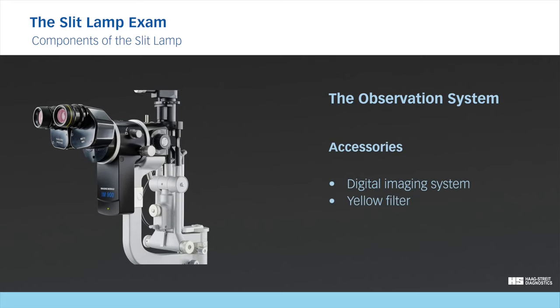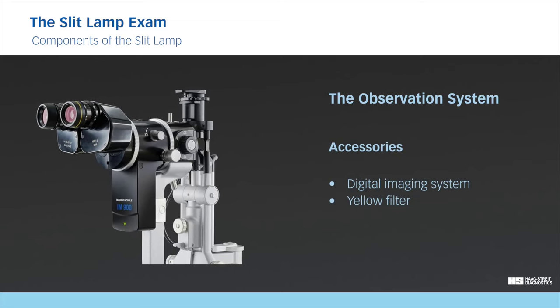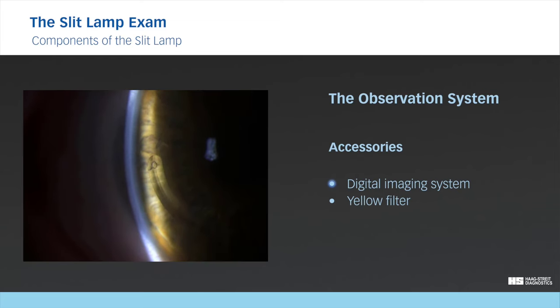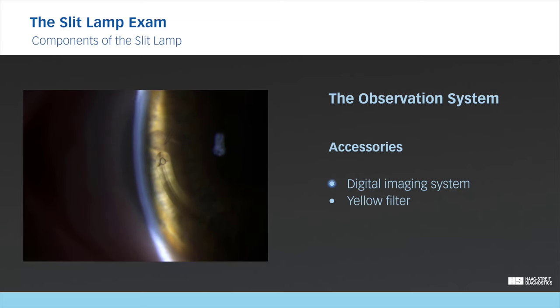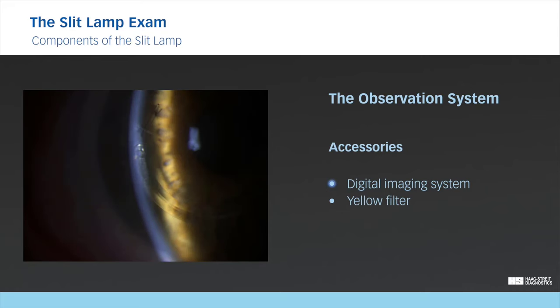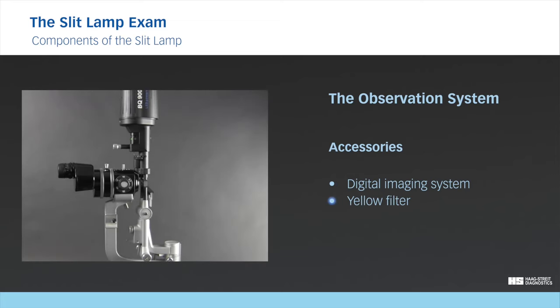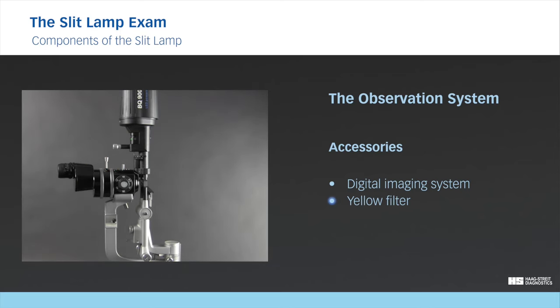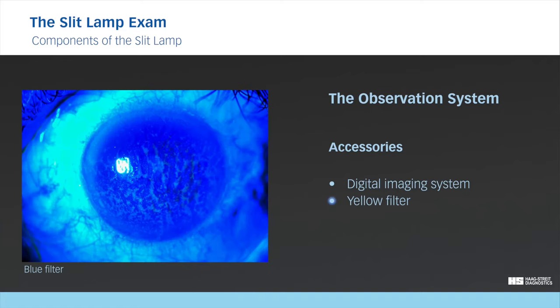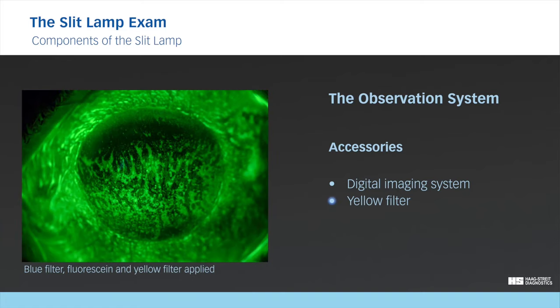Most modern slit lamps today offer the ability to integrate a digital imaging system. Digital imaging systems allow image capture of the view through the microscope, which is beneficial for documentation, teaching, and patient education. The yellow filter is an option that can be used in combination with the blue filter of the illumination system. It can be mounted permanently on the slit lamp and is easily engaged or disengaged as required. This filter combination improves the contrast when fluorescein is used by blocking the reflected blue light.